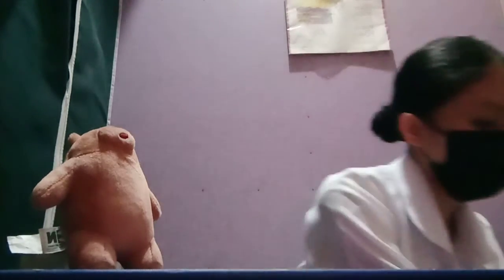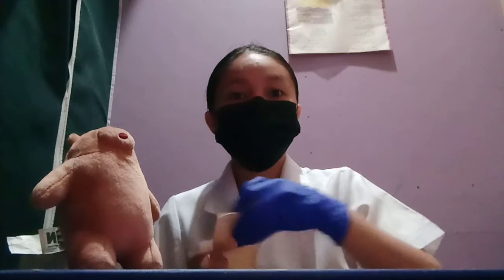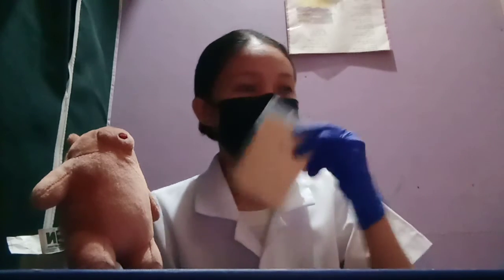Place the slide into the envelope, and place the envelope into the plastic bag. Then return it to the laboratory. Don't forget to also clean or disinfect your area.